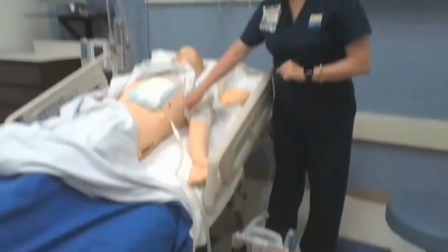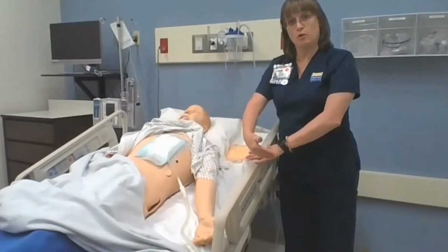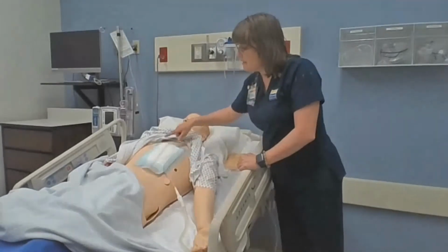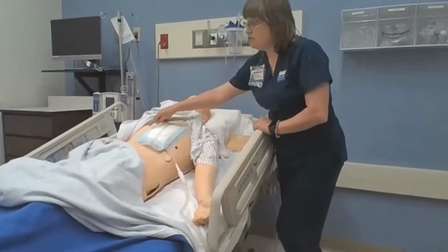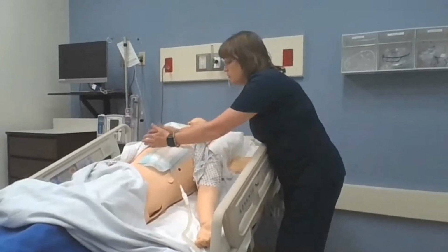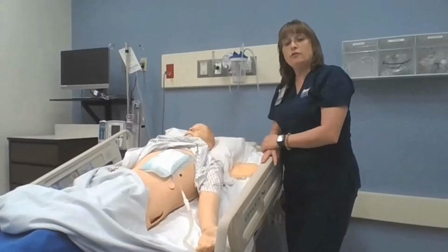Okay, so after I've looked quickly, I haven't really assessed it, I'm just making sure that it is taped. I'm going to start at the patient and we're going to work our way towards the drain because my main concern is the patient. The first thing I'm going to look at is I'm looking first. So I'm looking to see, is my dressing taped on all four sides? Now, here I have it taped in blue so that you can visibly see that it's on four sides of the chest tube. But in real life, it's normally that thick white tape and it covers the entire dressing. You have just sheets of that thick white tape. The dressing should be taped on four sides.